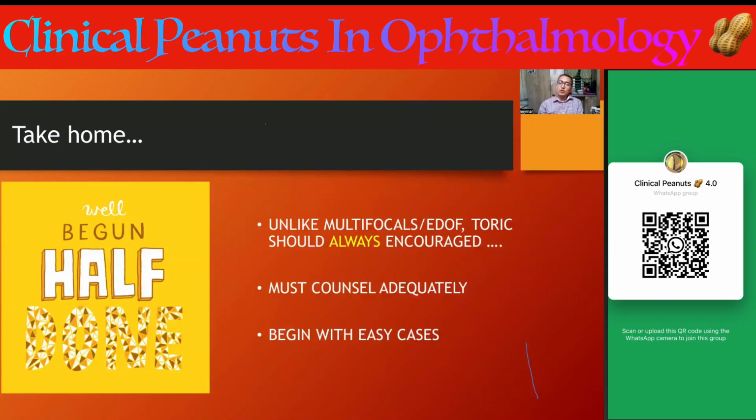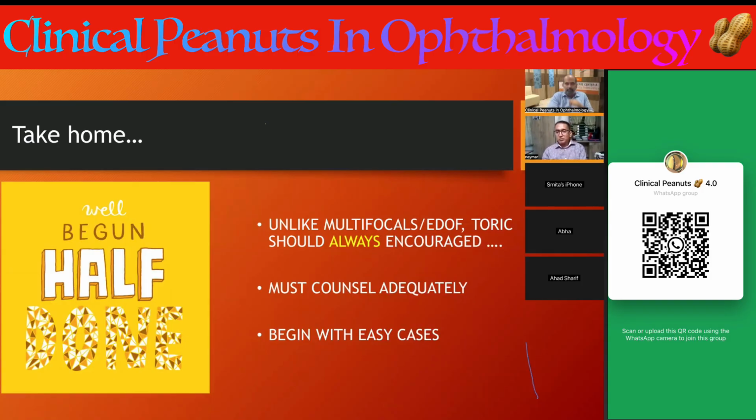You must counsel your patient, if a significant amount of astigmatism is there, to go for toric. This will definitely give you a very good visual experience. Begin with some easy cases, at least 5-10 cases, and unless and until you are experienced enough to take some difficult cases, then you go for the difficult.